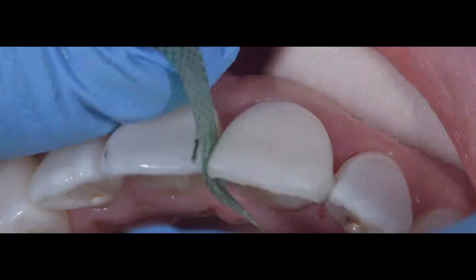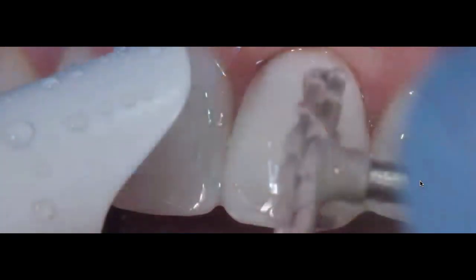This is a very thin, beautiful diamond finishing strip made by GC America that I also love. It gives you a very nice and smooth finish without removing your proximal contacts that you've worked so hard to accomplish with your mylar pulls. So this is another good thing that I tell you.